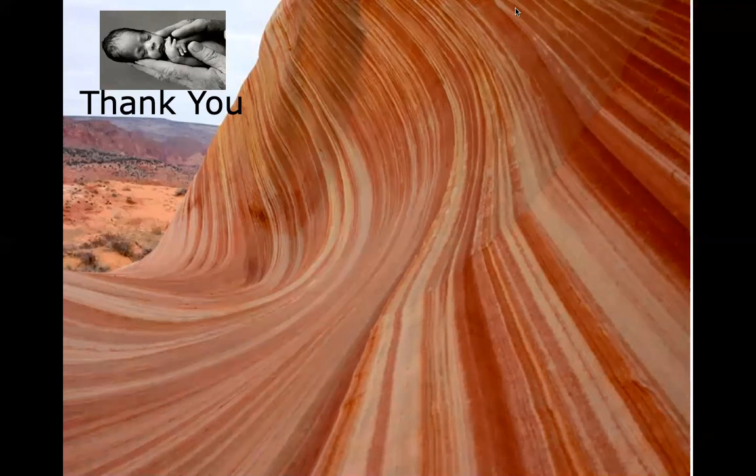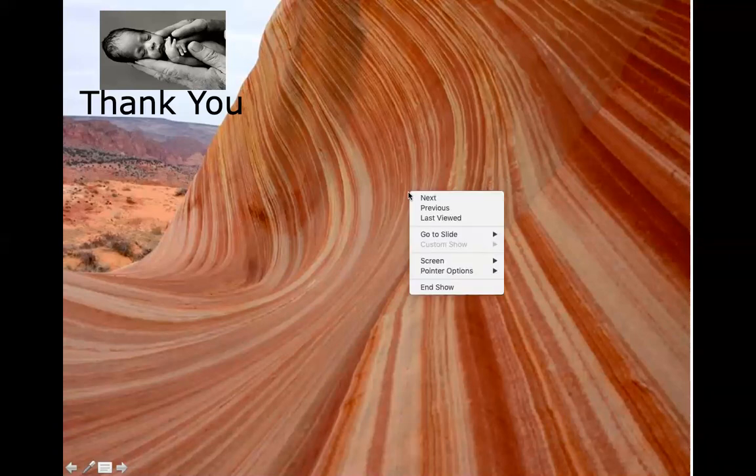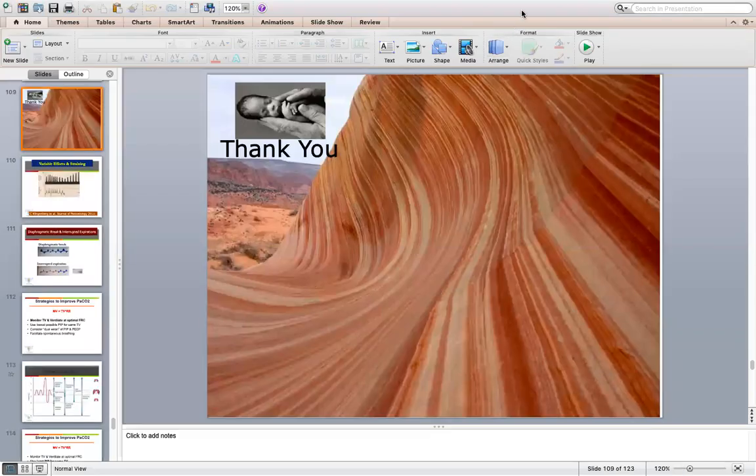So I do have one comment. I think using loops and graphics is very essential in state-of-the-art ventilation. When we do gas, how many gases can you do? Every hour, that's 24 numbers. Every 2 hours, that's 12 numbers. But with loops and graphics, it's continuous. So if you combine it with other modalities of monitoring, it's a beautiful way to monitor the baby.